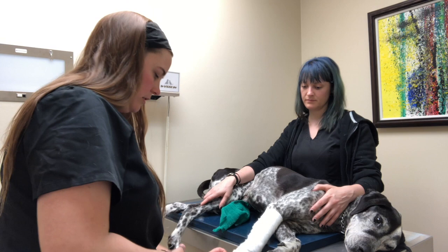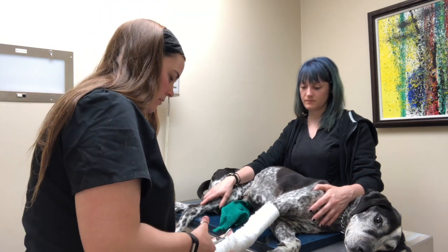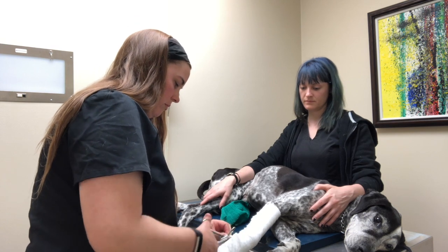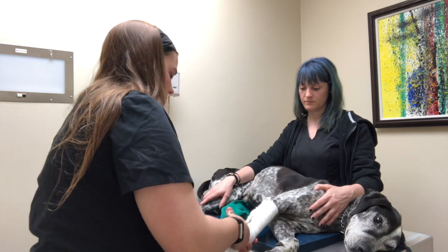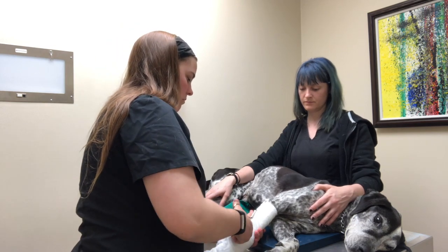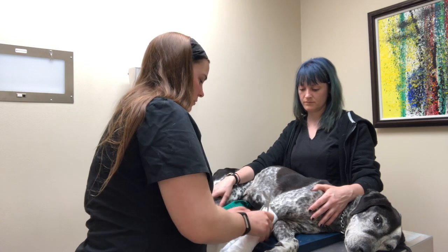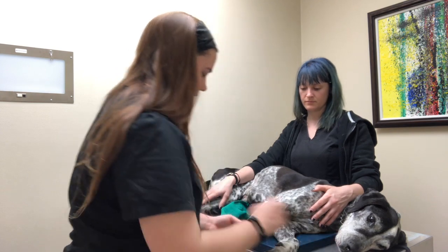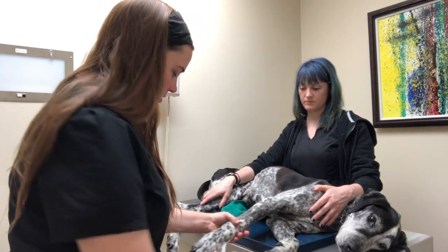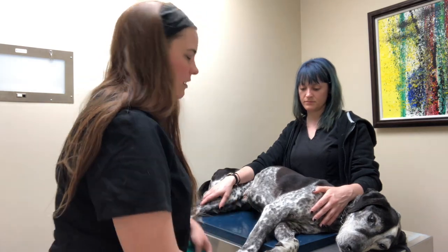Cast padding layer now. We can remove our tape gently from our stirrups. And that's how you remove your modified Robert Jones bandage.